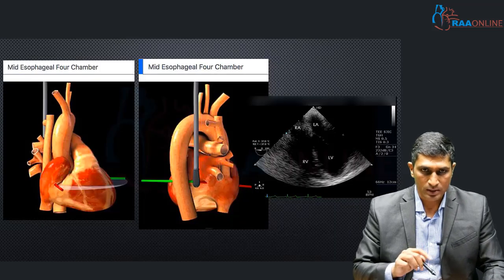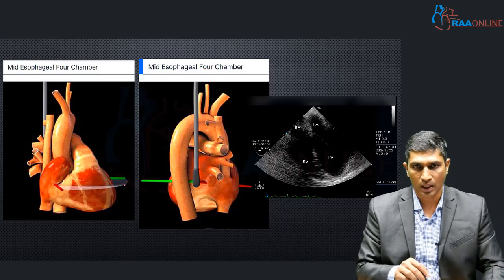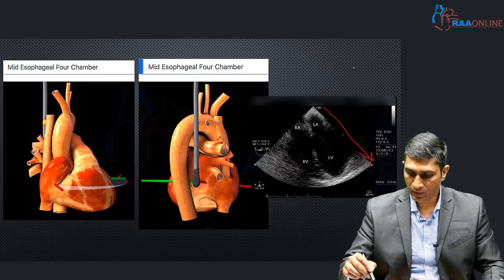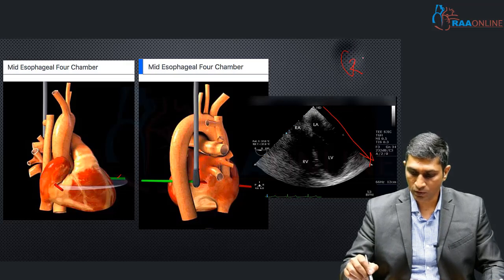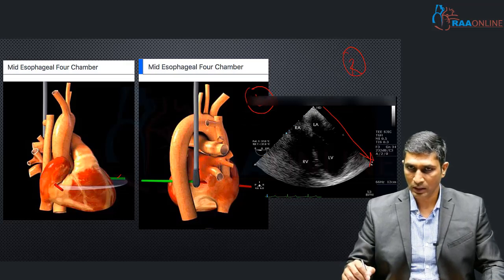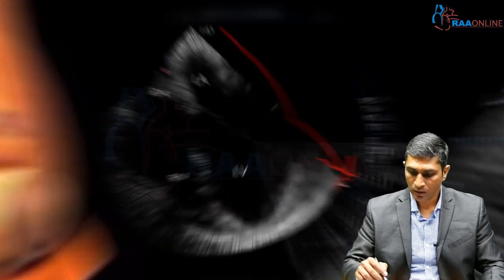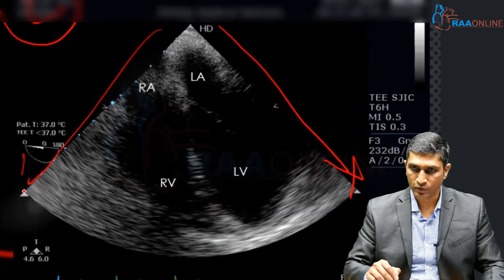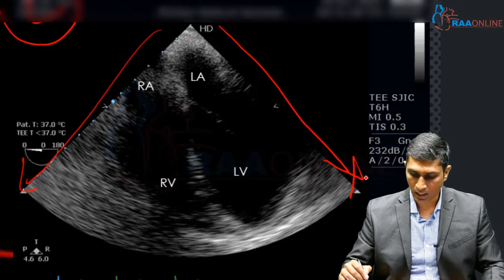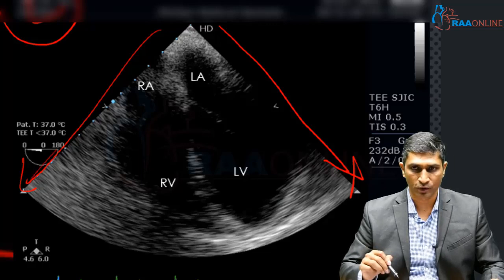The green line and the red line represent how the ultrasonic beam actually dissects the heart. The green is always on the right side of the image and the red is always on the left side of the image — this is the most important point to remember.